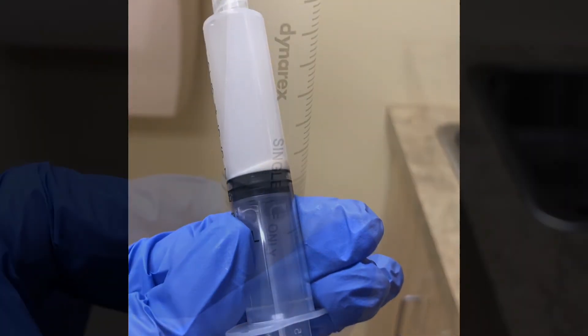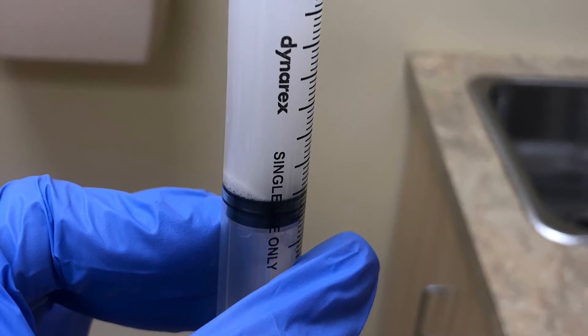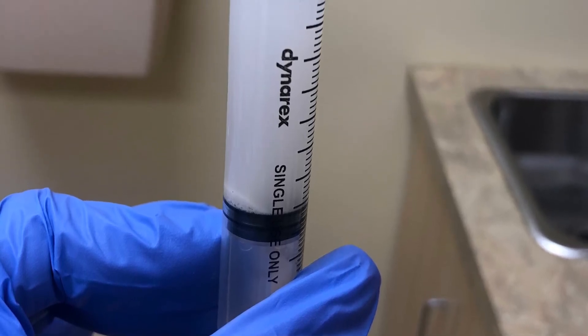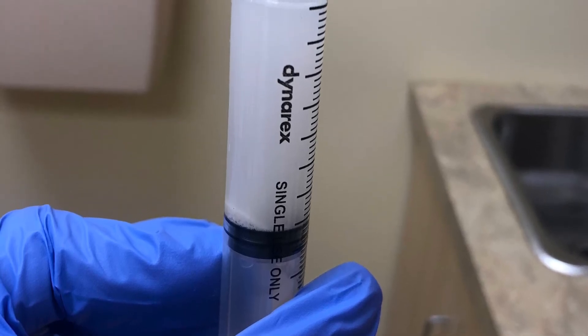Here you can see what the syringe looks like at the end of the procedure. Previously it was clear, filled with saline. Now, in addition to the saline, it is also filled with calcific residue from the deposit that was in the shoulder.